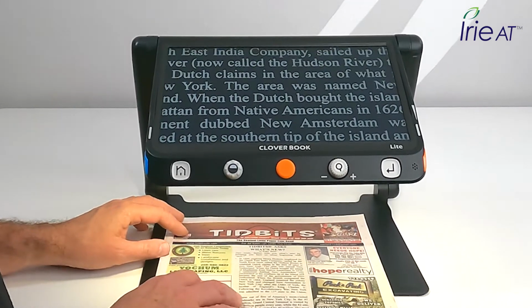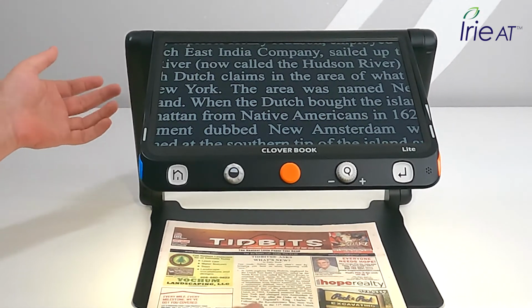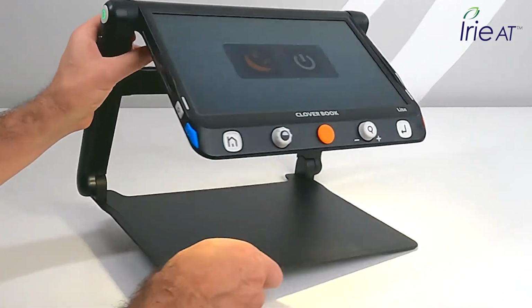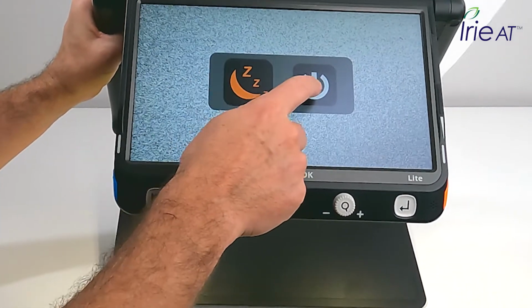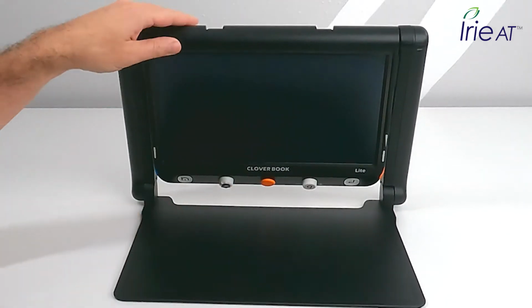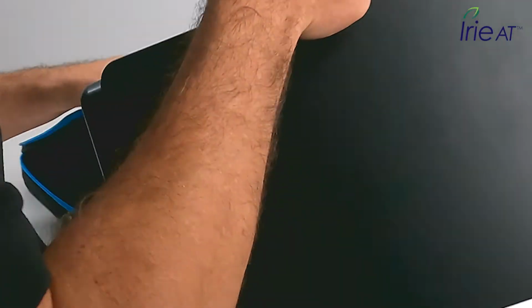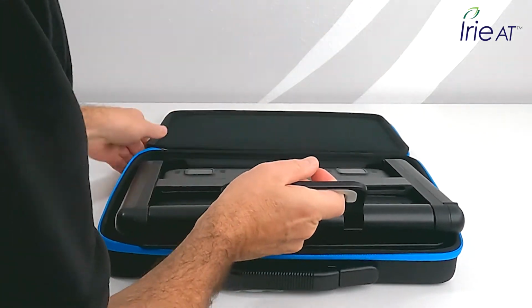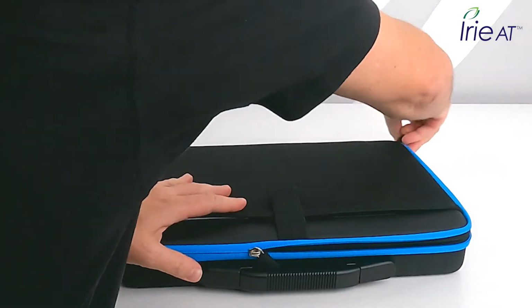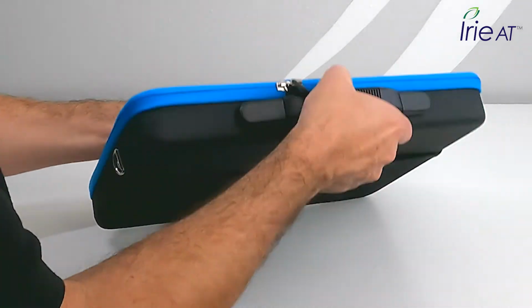Okay, so we're all done playing with our CloverBook Lite. So let's pack it up. Let's see how easy this is. Just gonna long press the power button. That's gonna bring up two icons on the screen, sleep or shut down. Press shut down, makes a nice happy sound. Fold in the screen, fold the unit in on itself. There's the case. And it's all ready to go.